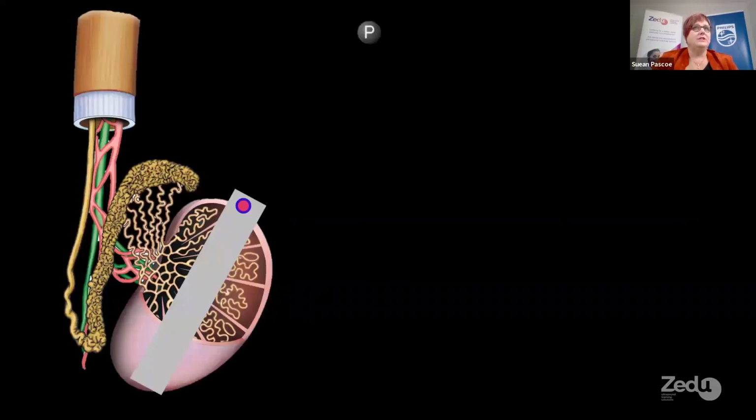So then we get busy actually scanning the structure of the testis itself. I like to start on the normal or unaffected side first. This gives me a benchmark for echogenicity, for the texture, and you know what it should be like. You need to then adjust your probe so that you orientate yourself to the longitudinal axis of the testis, which might be straight up and down, it might be oblique, it depends how mobile the testis is. You know that you're in a true longitudinal position when the testis is really nice and oval in shape.